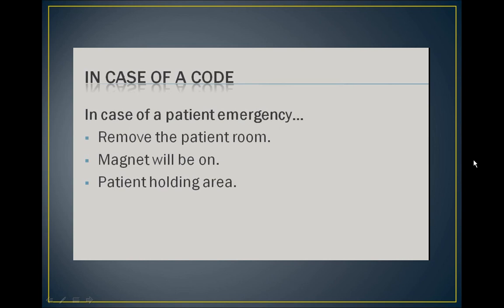We also do not want to allow a crash cart into the MRI suite. Even if the crash cart is rated MRI safe, the contents may not be. MRI facilities should have an emergency procedure in place in case of codes. These procedures should be practiced regularly so the staff is clear on what to do if this ever happens.